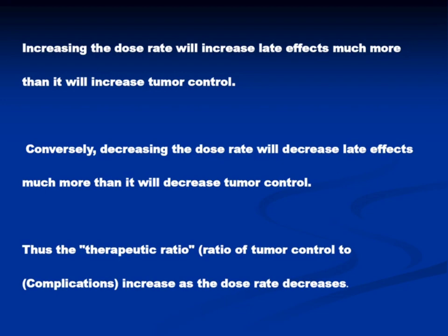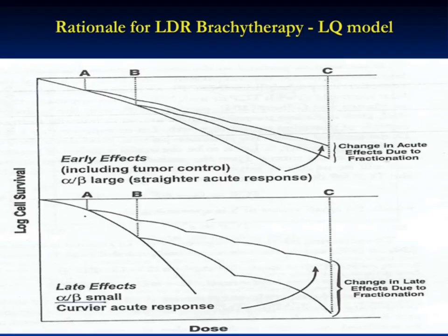The time for which the implant must be left in place is derived by dividing the prescribed dose by the reference dose rate. How much dose you have prescribed should be divided by the reference dose rate, which you have found with the help of the basal dose rate. It used to be done this way earlier, but now the whole problem is solved by the 3D treatment planning system. So here you see how we calculated the superficial plane with 2 wires and the deep plane with 3 wires. Nowadays it is done by the treatment planning system.